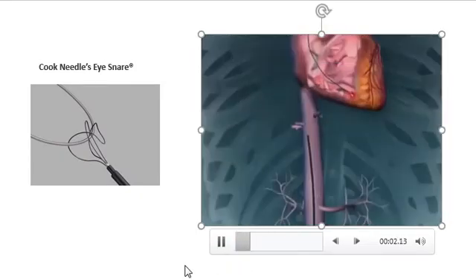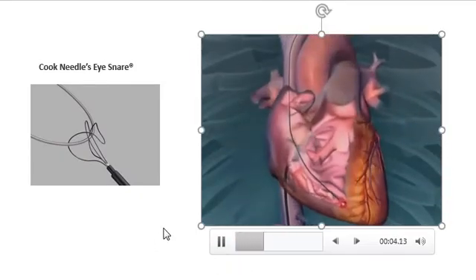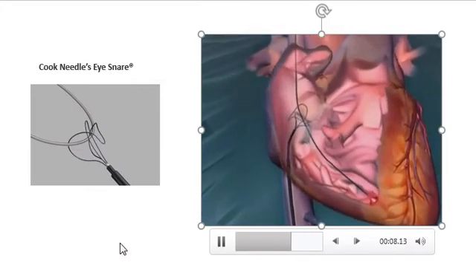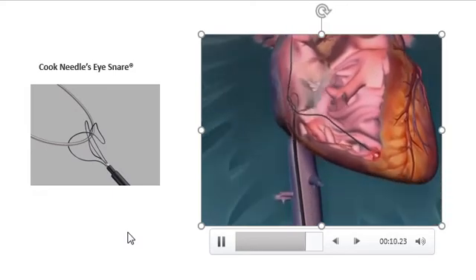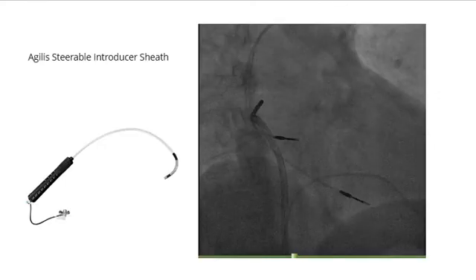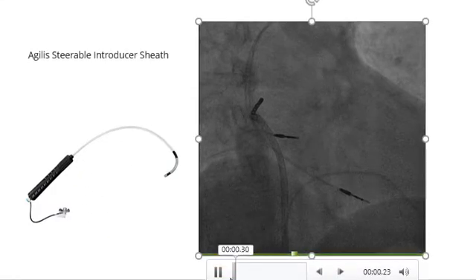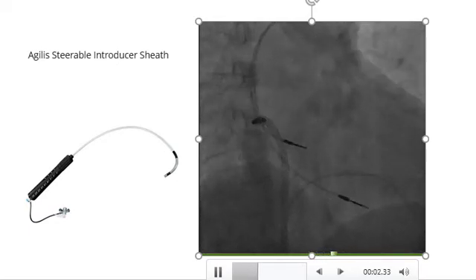Unfortunately, the needle eye snare is not available in our country. You can see how this tool works — it grabs the pacemaker leads. In our case, from a femoral vein approach with the use of an Agilis sheath and an ablation catheter, we made a loop around the two pacemaker leads in the right atrium.